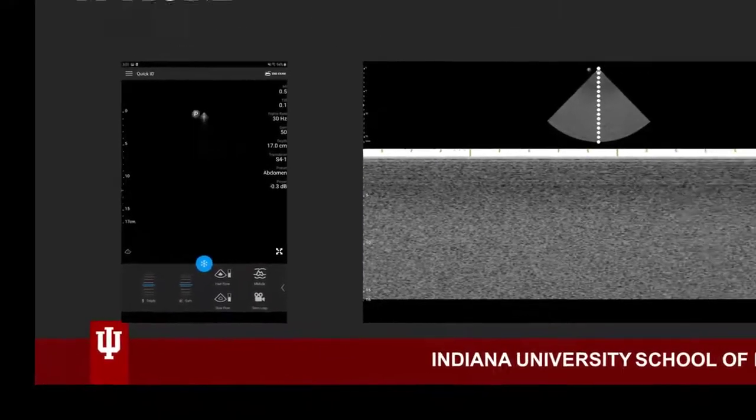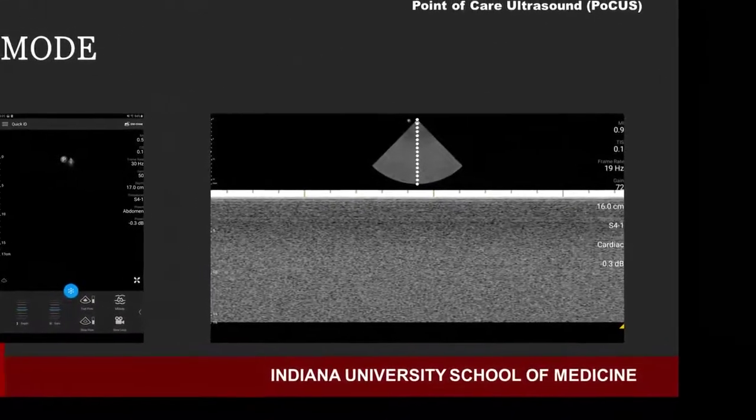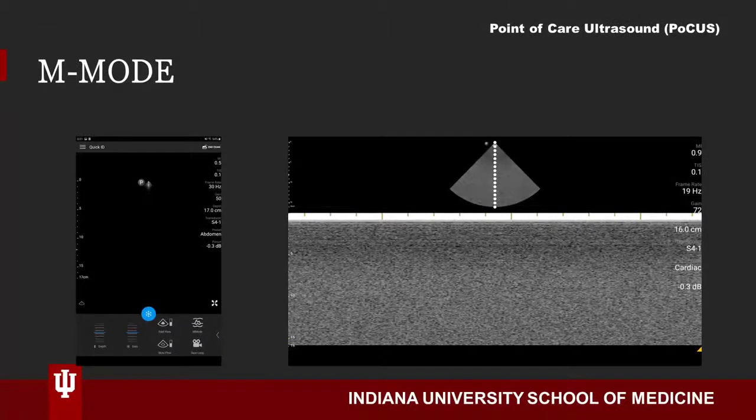The color Doppler mode will engage immediately upon selection. You can modify the area of interest with your stylus or finger on the screen. The M mode function, however, will initiate with the first press and engage with the second press.